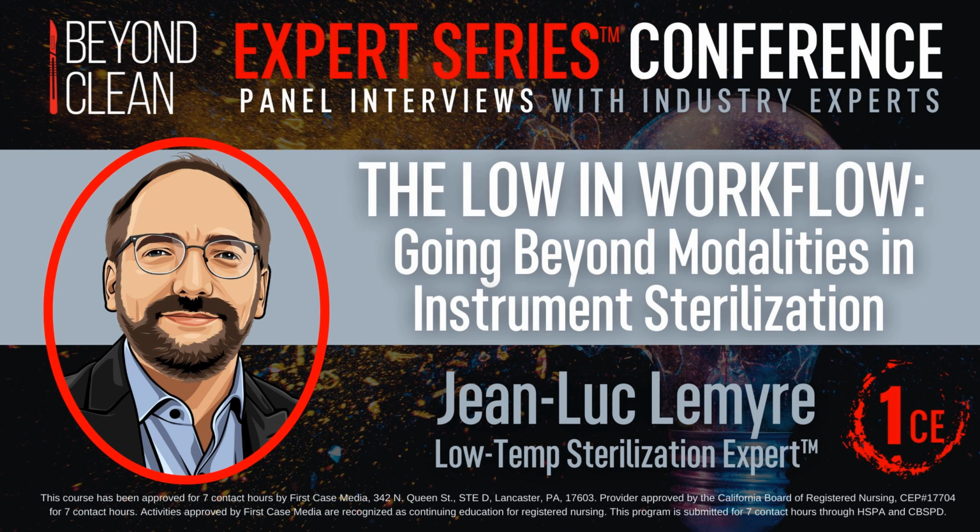As I've been talking with sterile processing professionals in the field, when I ask them the question, what would you like to see out of your low temp sterilizer? The two pain points for sterile processing are one, aborted loads because of moisture, which we kind of already talked about, and the other one has to do with throughput.